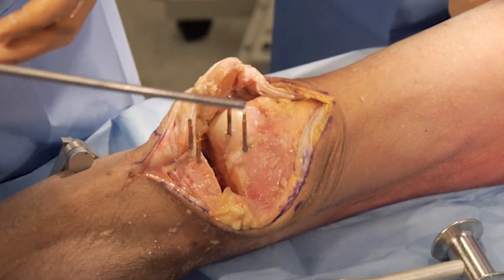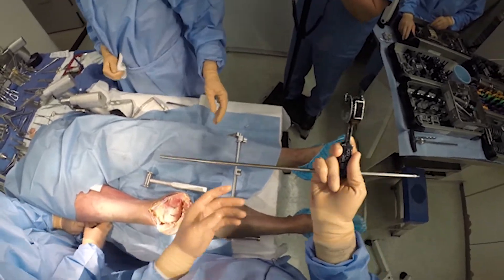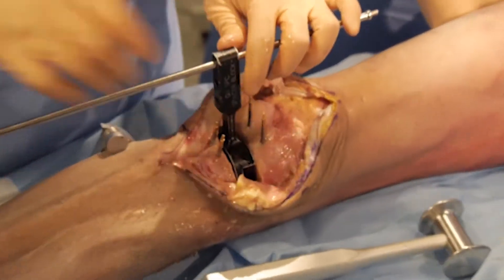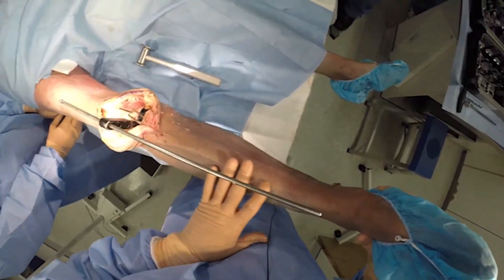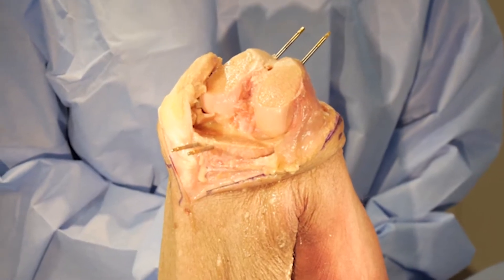At this point I'll check my extension space to make sure I've taken enough bone, both on the distal femur and on the proximal tibia. This is a 9mm spacer block with an alignment rod attached. I'll place this 9mm block into where I made my cut, bring the knee into full extension, and check alignment — it should go right down the tibial shaft and aim towards the second metatarsal, which it does. So now I'm ready to move on to the distal femur.